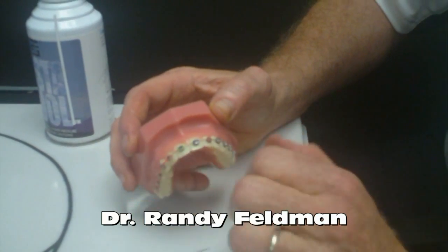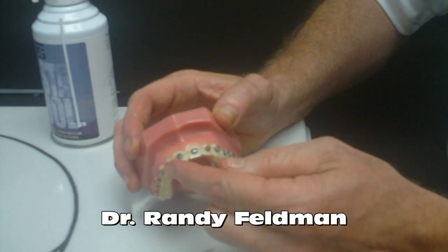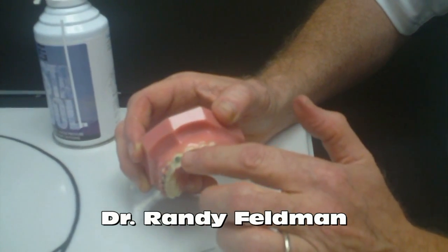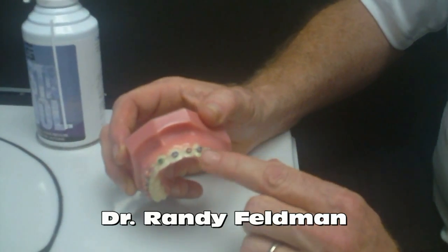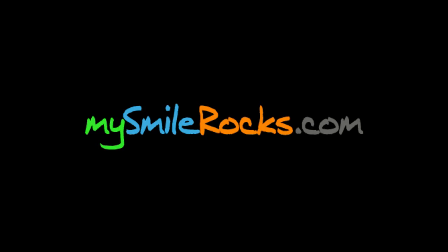Nowadays, there are all sorts of brackets that exist that are trying to become more efficient. We still have cosmetic brackets that are ceramic, and we have other brackets that have a little metal clip that actually self-ligate, so you don't have to put the elastic or the steel tie on there. There are a lot of different schools of thought on which is more efficient, but right now we're showing an example with an elastic ligature and a steel ligature.